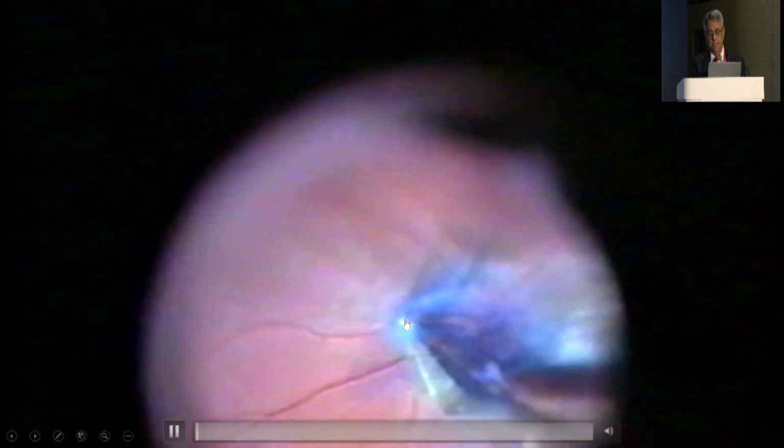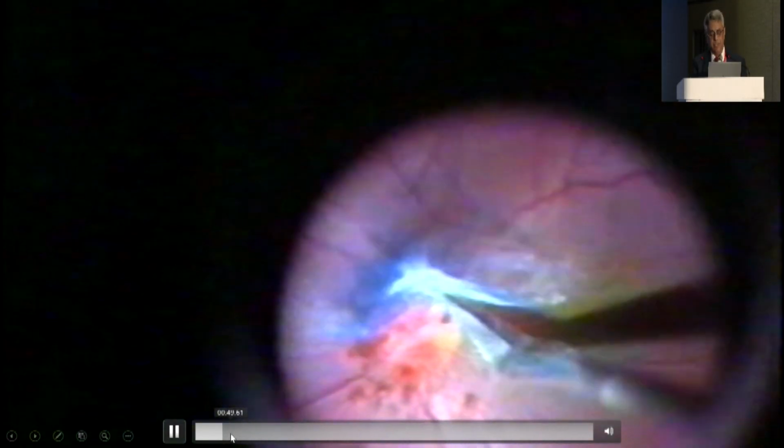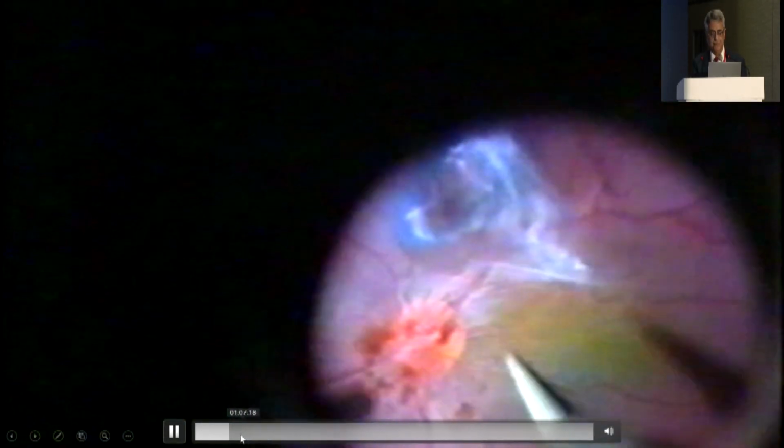So this small video shows 3-4 kinds of pathologies, 3-4 kinds of membranes in various situations, all epiretinal membranes. So this was a bent MVR blade, a huge membrane over the disc as well as the macula, the entire posterior pole. After identifying the edge, in fact without the forceps also, we kept continuing, and the membrane was obliging us, and it came off very nicely in a single plane with no complications to the underlying structure at all. But most of the time we tend to use the forceps rather than continue like this.